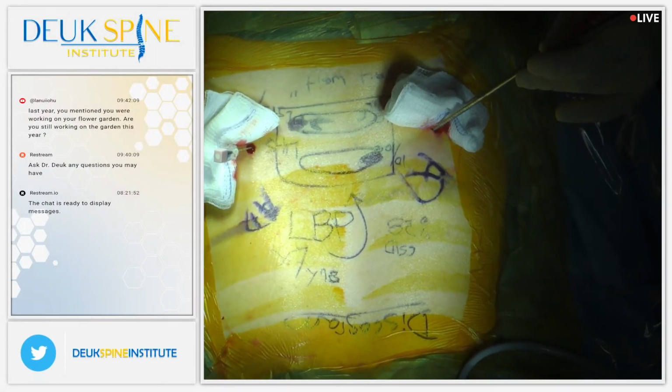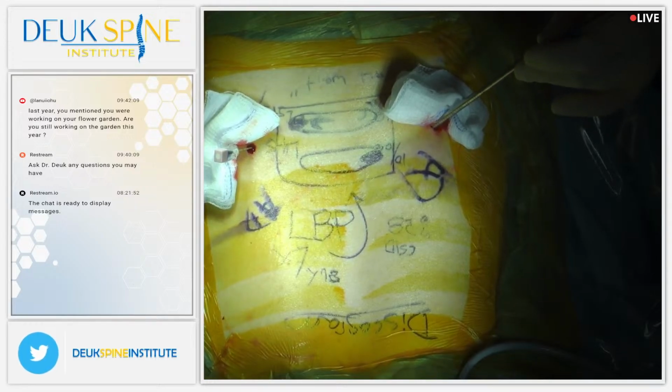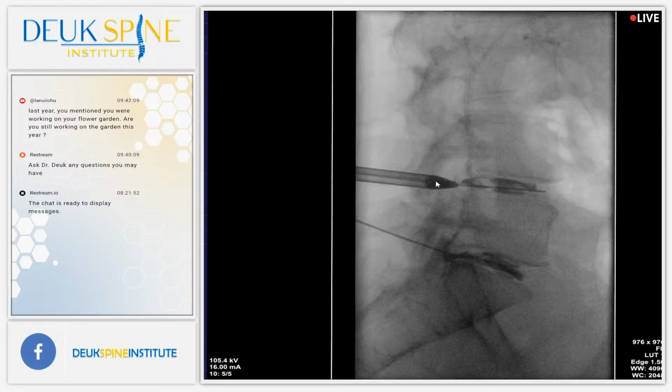Let's see why it's painful. Jordan, show us the x-ray. Anthony, go to the x-ray view. You can see the dilator, right? It's sitting right there where the herniation is. You see this little faint dye right there? That's the herniation right there. You guys see the shell? Show the shell of dye. See the black line? And then you see the tear in the back wall of the disc where the dye is leaking out. That's the dark stuff leaking out through the tear. There should be no dye leaking out, but there is. Am I ready? Yes. All right.